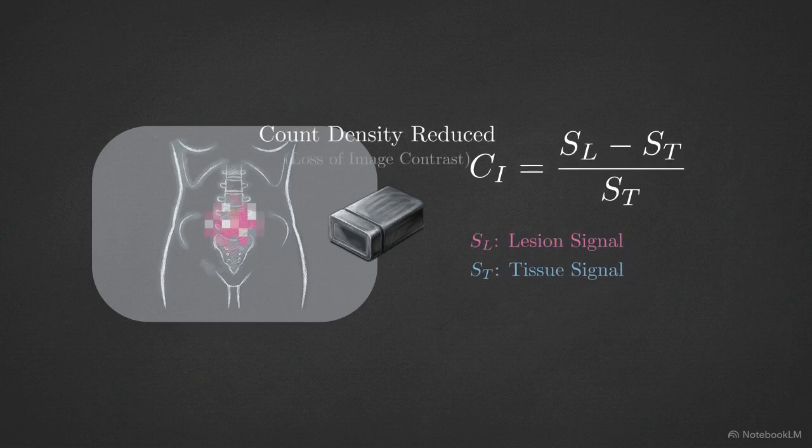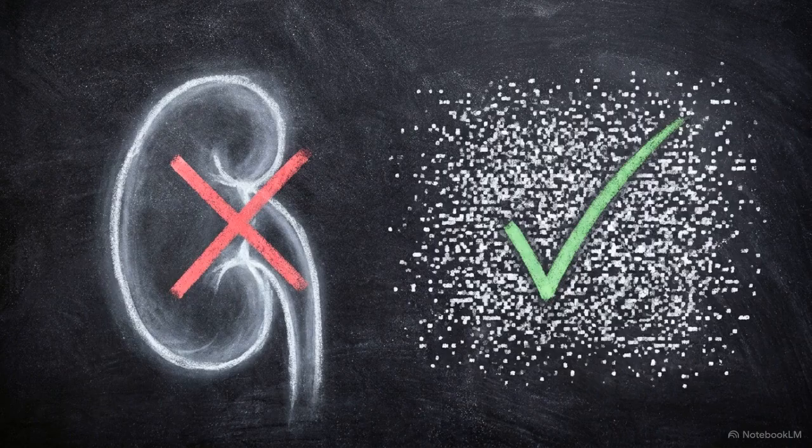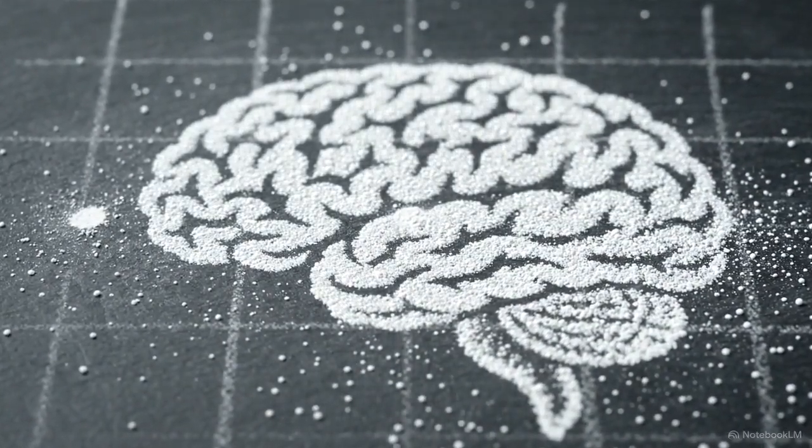The count density per pixel drops dramatically compared to biological activity. Because of attenuation, scatter, and background radiation, the image contrast displayed on the monitor is a direct physical degradation of the true subject contrast. Once the signal reaches the camera, we encounter the second constraint, noise. We can ignore structured noise, which comes from unwanted physiological uptake, and focus on the primary obstacle, random noise, or quantum mottle. Radioactive decay is a random process. The image is built from unpredictable, sporadic emissions governed by Poisson statistics.